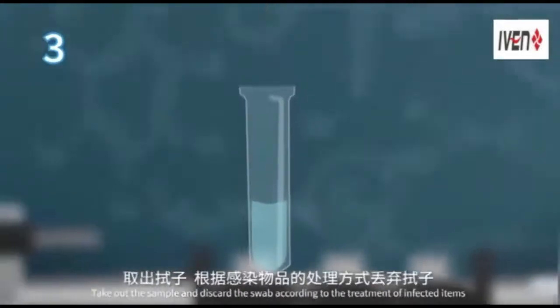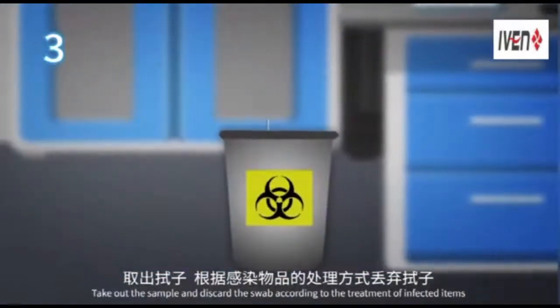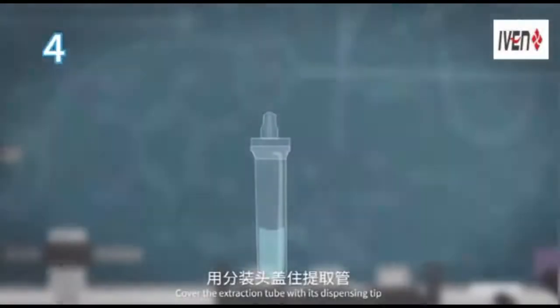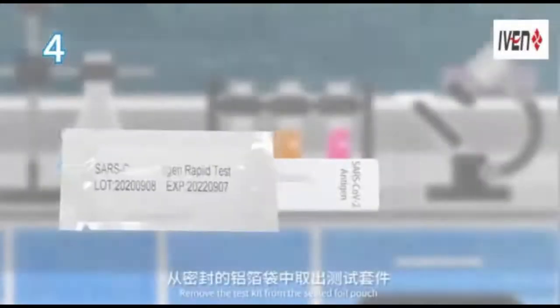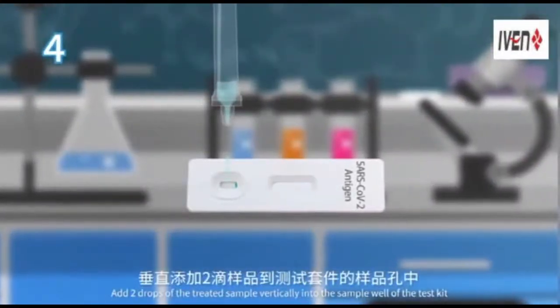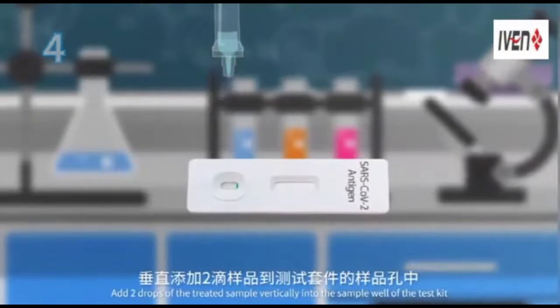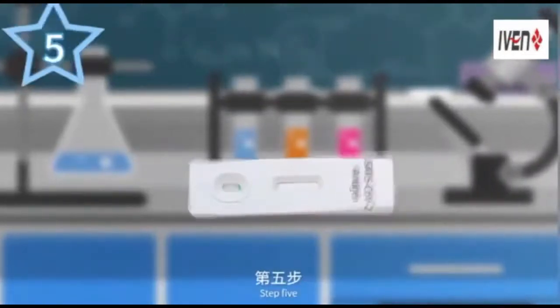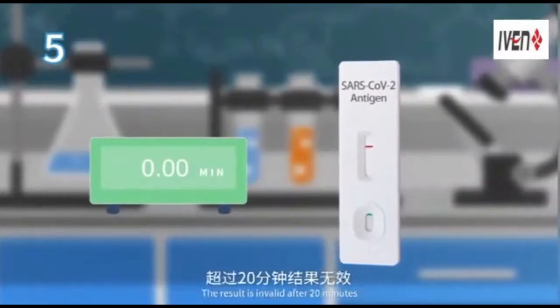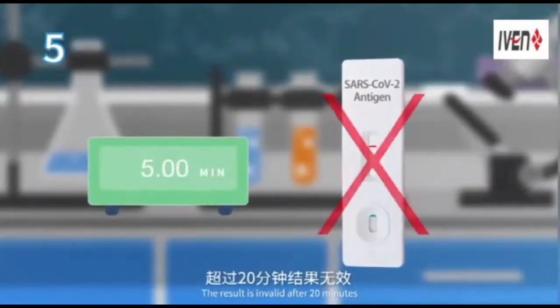Take out the sample and discard the swab according to the treatment of infected items. Step 4. Cover the extraction tube with its dispensing tip. Remove the test kit from the sealed foil pouch. Add 2 drops of the treated sample vertically into the sample well of the test kit. Step 5. Wait 15 minutes to interpret and record the test result. The result is invalid after 20 minutes.